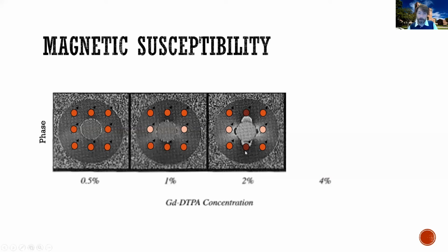Because these 4 now live inside the distortions created by gadolinium. So now we have 4 protons going at the same resonant frequency and 4 protons in pairs of 2 going at completely different resonant frequencies. They're going at different Larmor frequencies.